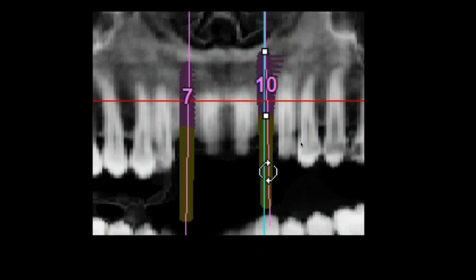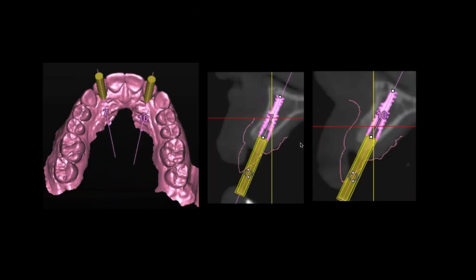I got some impressions on it. You can see we have a 7 and 10 straight up and down. So we got them lined up. They're coming out on the lingual, so this is going to be screw retained.